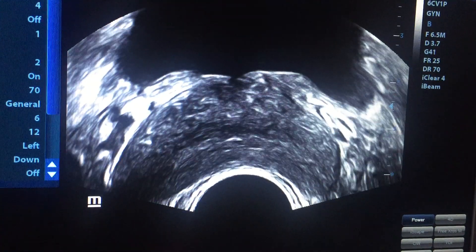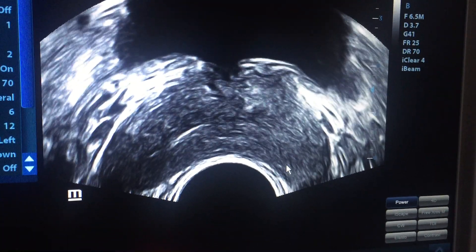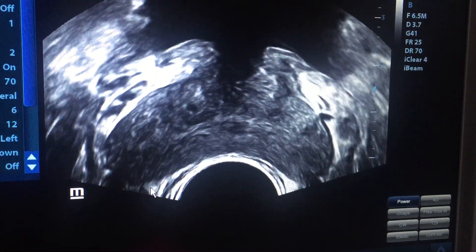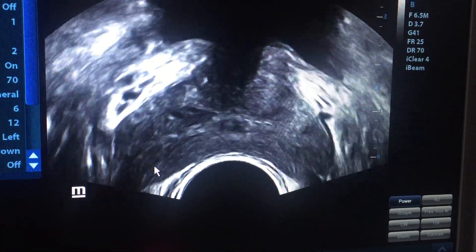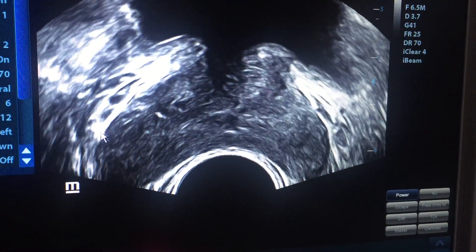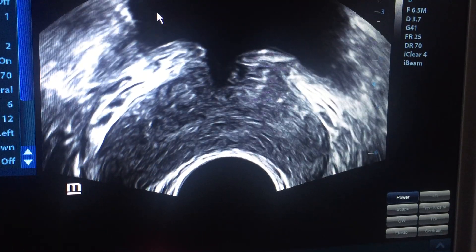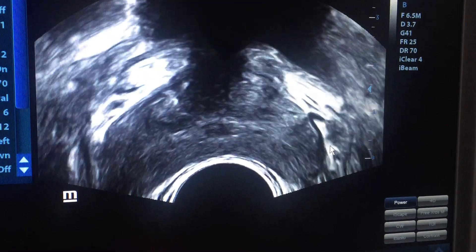After this, we are checking the prostatic parenchyma. The prostate is clear. This is the central zone and this is the peripheral zone. Here is the probe and this is the urinary bladder. This is the neurovascular bundle at the vesicoprostatic pouch.